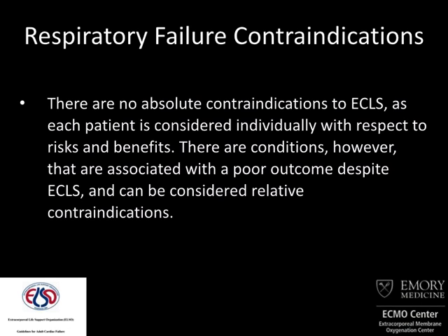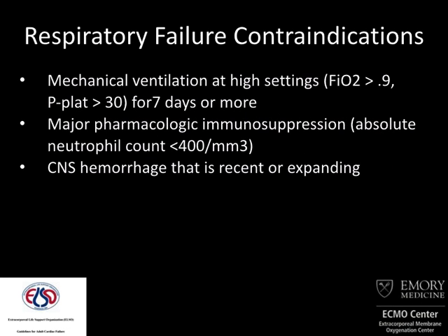Contraindications also says there are no absolute contraindications. Use good judgment, essentially, is what they say, and accept the fact that patients may not do well. This is difficult to consider because there are a lot of patients where you put them on ECMO and you say this would be a crazy thing for us to do. And so I think it's important to weigh what the contraindications may be. Things that they do tend to agree on, though, are this.